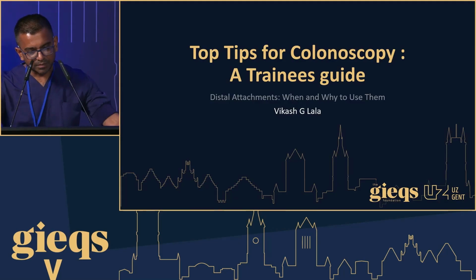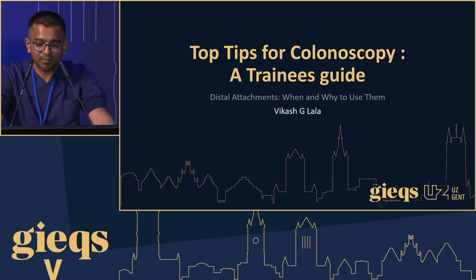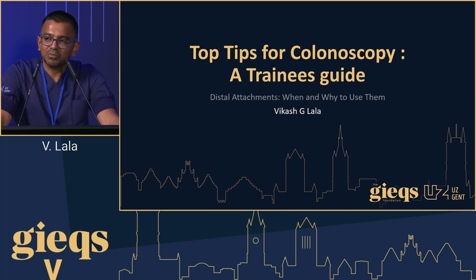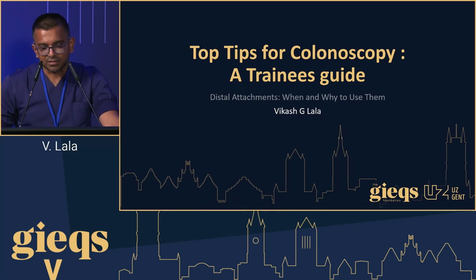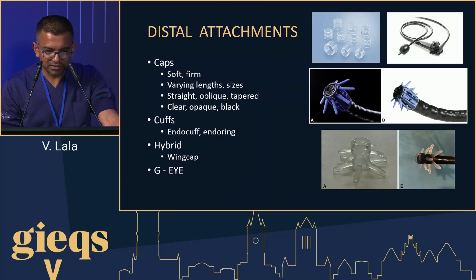So I'm going to take you through a quick run through of distal attachments, when and why and how to use them as well. I think you would have noticed probably throughout the seminar that for almost all cases, you would have seen a distal attachment at the end of the scope. And there is a reason for that. It's not just random. These are the lecture objectives, and let's just get into it.